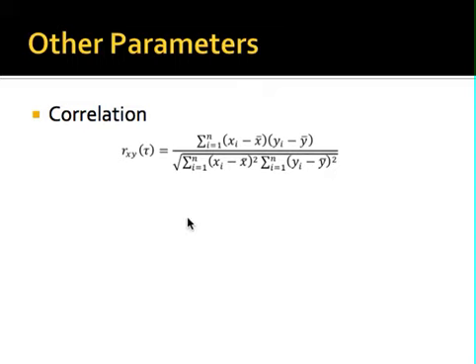There are some additional parameters. One is phase synchrony, which has been used quite a lot to replace frequency coherence, or to augment frequency coherence. I'm giving you a reference to a paper as a part of the course that really summarizes a number of different connectivity techniques and looks at how accurate each one was at classifying a pretty well-defined classification problem. So that's part of the reading assignment and really should supplement this series of lectures in different EEG parameters and connectivity measures.